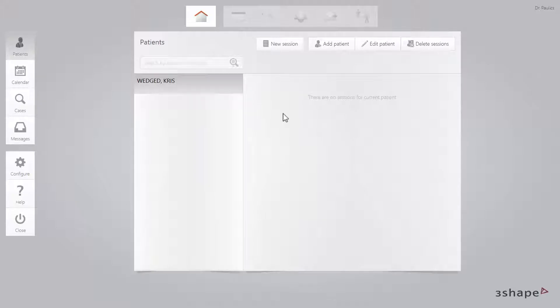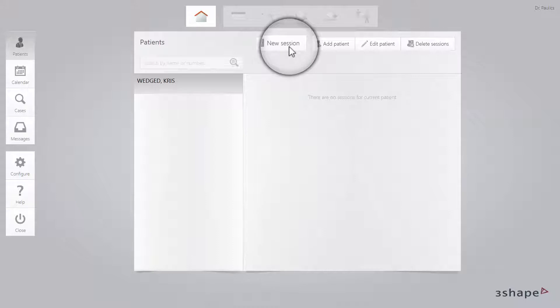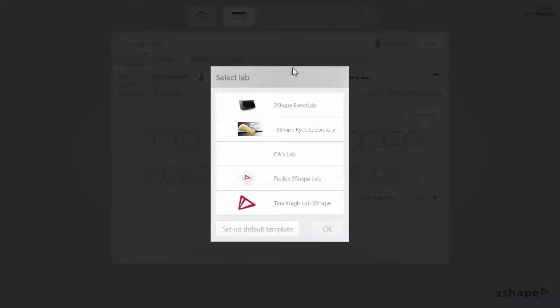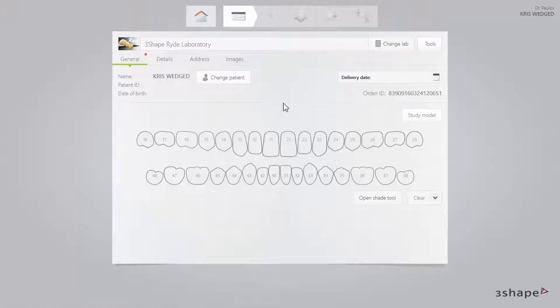Starting on the Patients page, click New Session and select the lab. If you have only one lab, this lab is automatically pre-selected. The order form will appear.